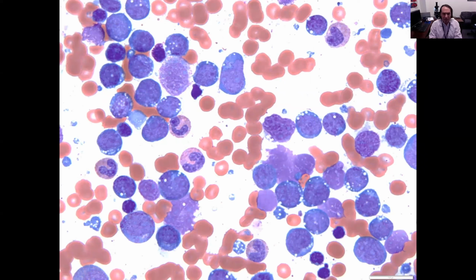Speaking of Burkitt leukemia, here is a case of a marrow from a child with Burkitt leukemia. You can appreciate that the cells are intermediate sized blasts. They're somewhat larger than neutrophils. They have mature appearing lymphoid chromatin, often with multiple, often peripherally placed nucleoli. They have this deeply basophilic cornflower blue appearing cytoplasm, often with cytoplasmic vacuoles that would be fat if one were to stain for fat.